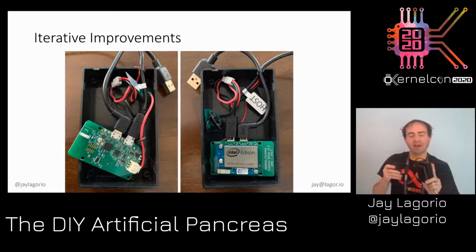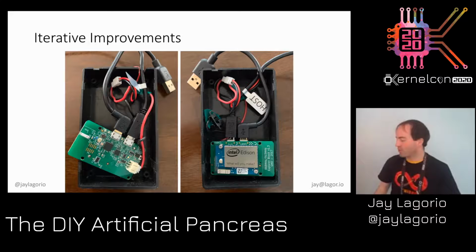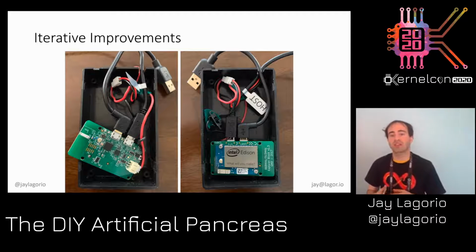And the reason that you need the battery is because USB on the go requires that 5 volts. If you are just reading off the Bluetooth, this 3.7 volt LiPo is just fine. That'll get you maybe 8 hours if you're using Wi-Fi, and something like 12 if you're just using Bluetooth tethering.